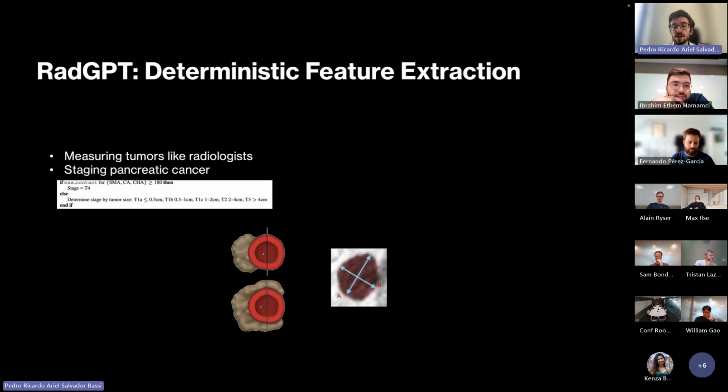So we look at the degree of contact across the whole blood vessel, and we check which is the maximum degree of contact between the blood vessel and the tumor. If it's smaller than 180 degrees, like is shown in this image here, the tumor is not encasing the blood vessel. If it's larger than 180 degrees, it is.